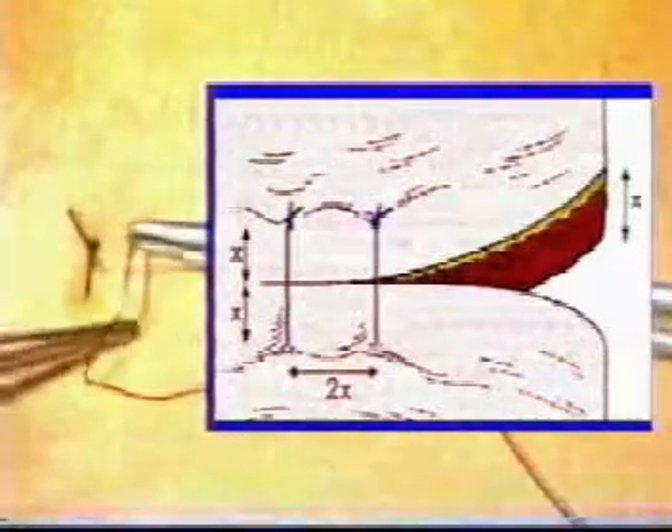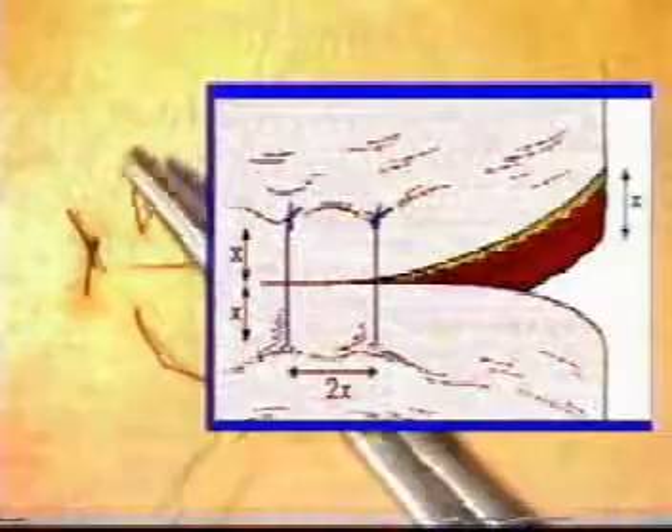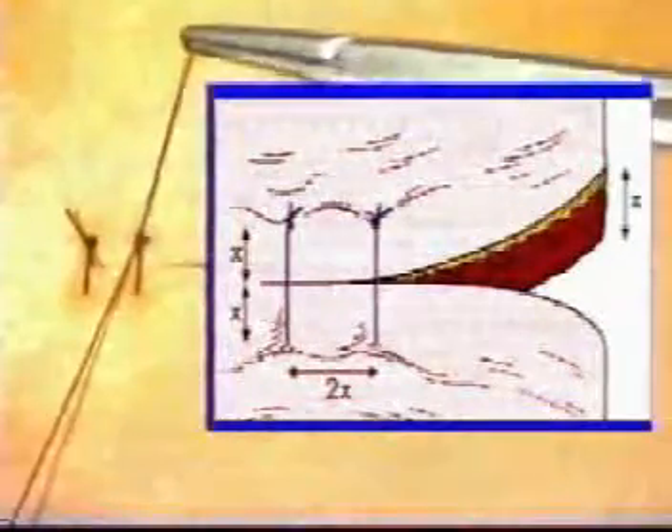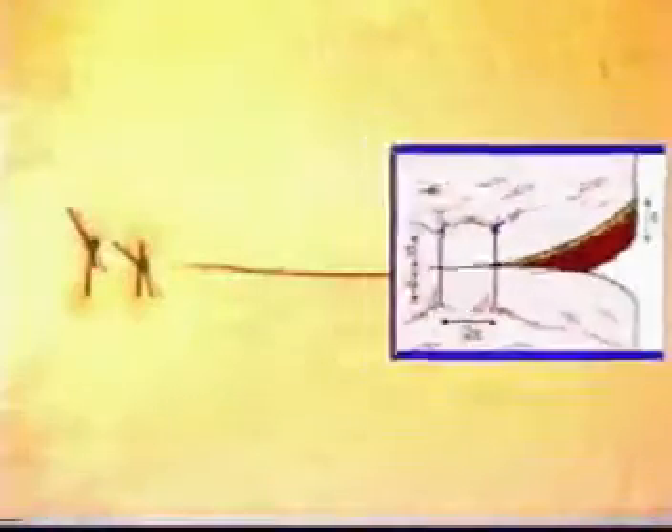As a rule of thumb, the distance from the edge of the wound should correspond to the thickness of the tissues being sutured. Each successive suture should be placed twice this distance apart, approximately double the depth of the tissue being sutured. Continue to insert your sutures in this manner across the entire wound.